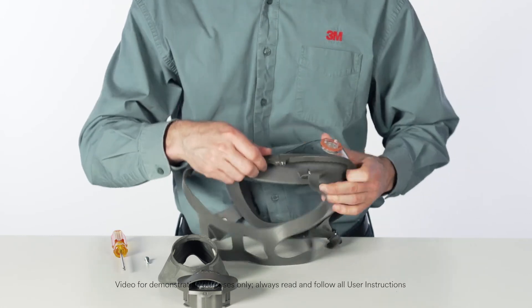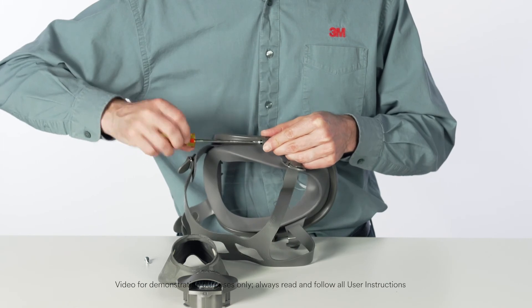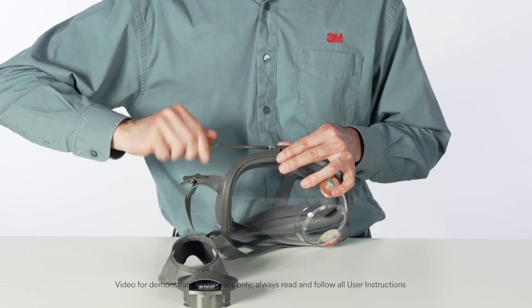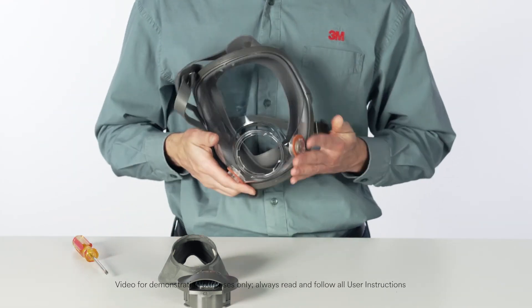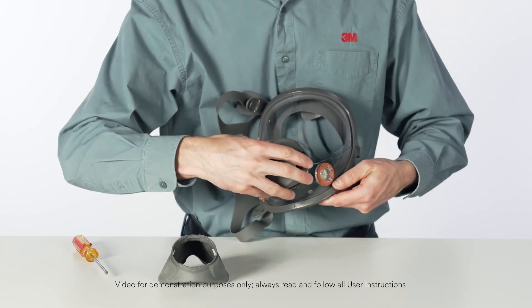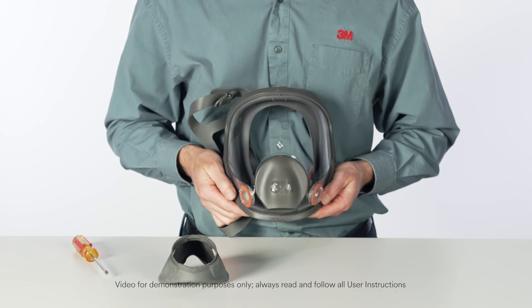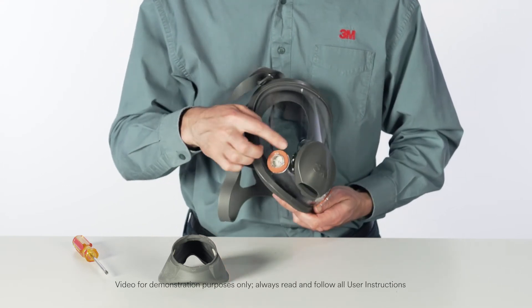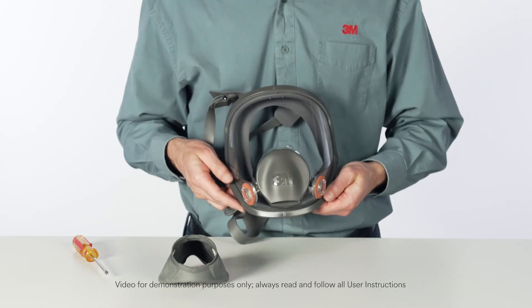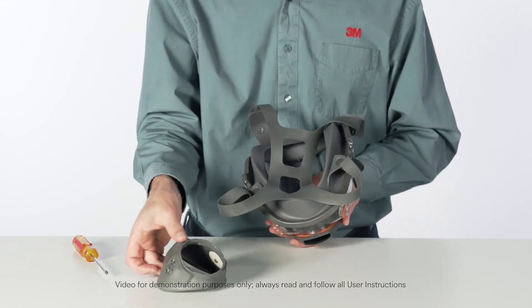Install and securely tighten the screws. Install the center adapter assembly by aligning the tabs on the center adapter base with the notches in the center port of the facepiece lens. Slide the adapter into the lens port and twist it clockwise one quarter turn to stop. Be certain that the center adapter gasket is properly in place and sealed and that the adapter assembly is fully engaged.